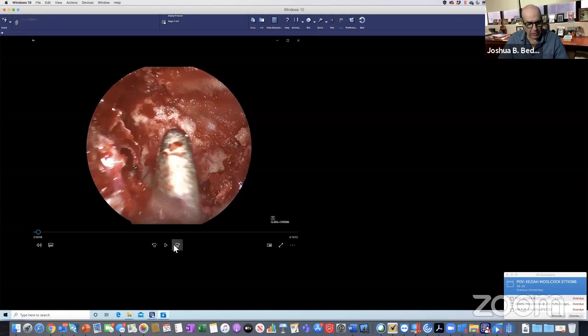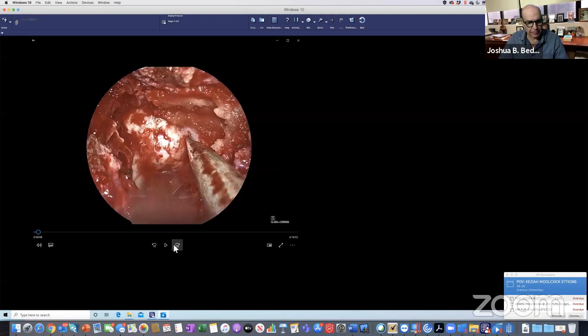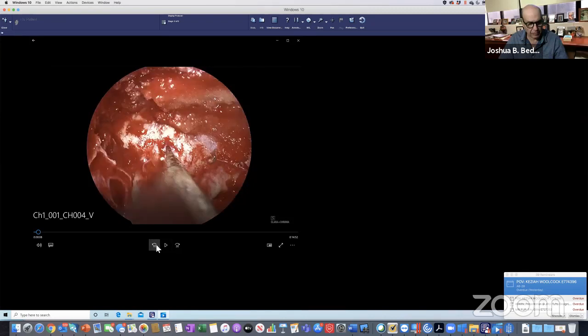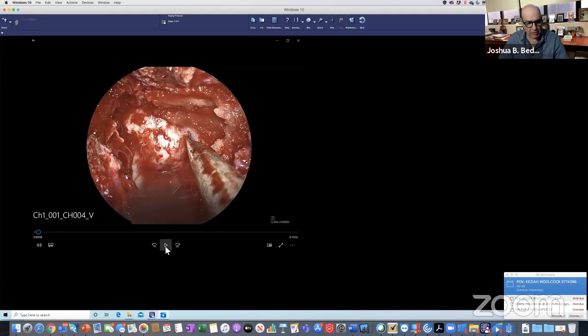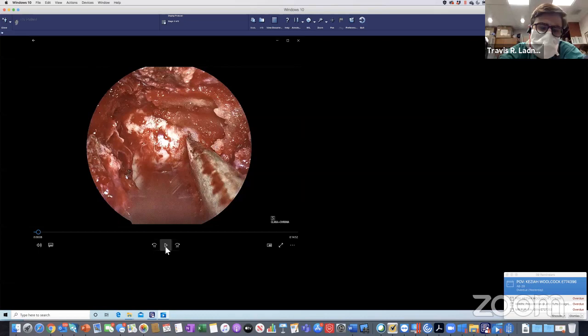How would you identify whether or not you are in the right location? We could use stereotaxy to confirm as one adjunct. So that's what this is there. And then how would you want to double confirm it? There's kind of a divot where the opticocarotid recess exists. There's kind of a curvature of the carotid as it goes into that. Yes, I think that you can visually confirm.